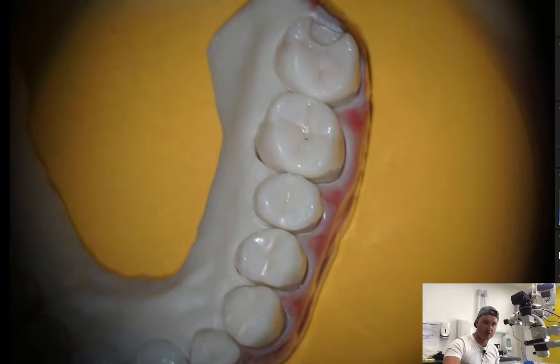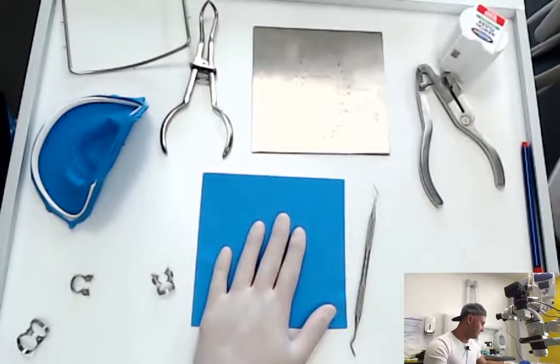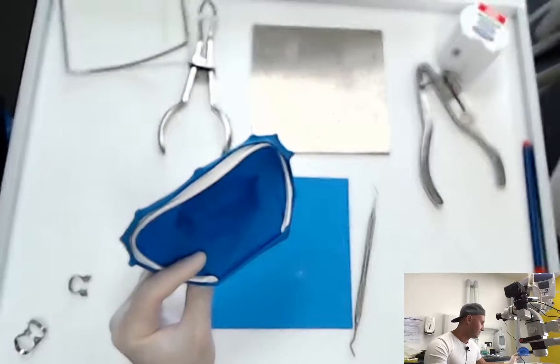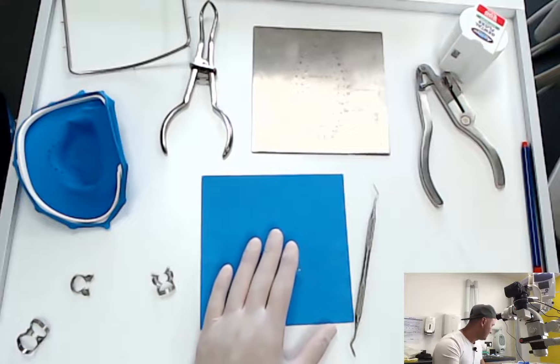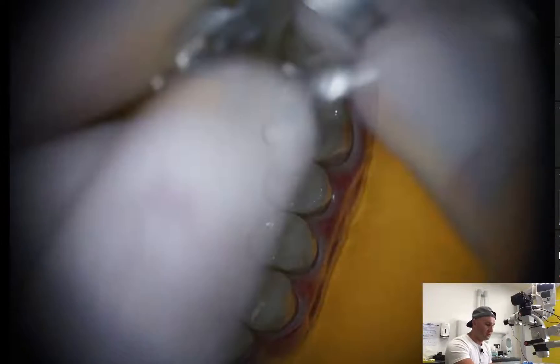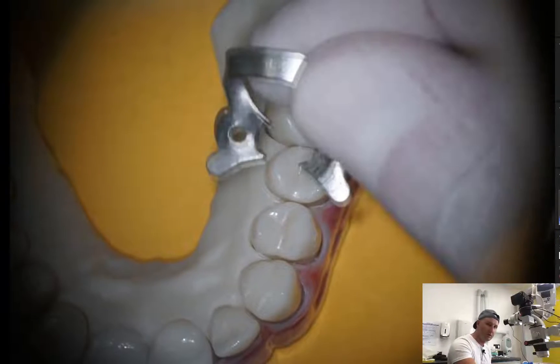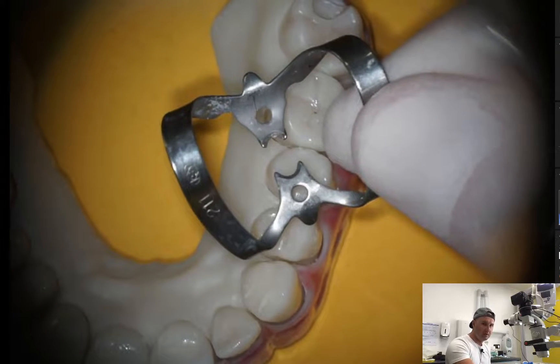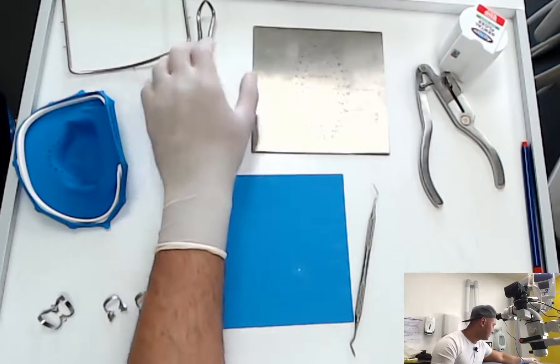We want to place the rubber dam only on one tooth. What we are going to need is the rubber — the simplest square shape, or this profiled one. I prefer the profiled one because it's easier and more ergonomic, but I'll show you the standard one. We'll need a rubber dam clamp — for molars when we place the rubber dam on molar teeth, for premolars when we place it on premolars, or this butterfly type if we place the clamp on one of the anteriors.